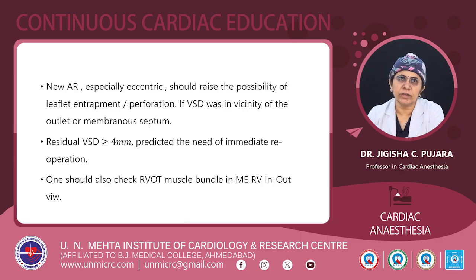A residual VSD less than 3 mm many times you may not need to address, but a VSD of 4 mm or more usually requires reoperation. You have to go back on bypass and close this VSD, otherwise it can give trouble. The patient is in failure, may not come out of the ICU, prolonged ventilation and failure chances are very high, and in future vegetation also is very high. So one should be very careful to look for the residual defect.